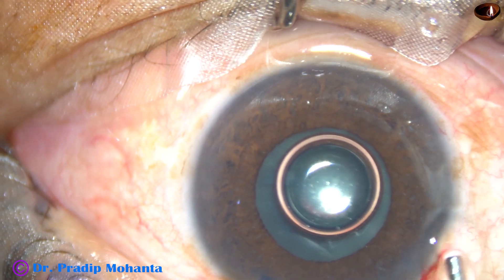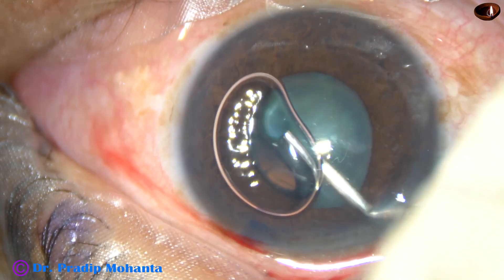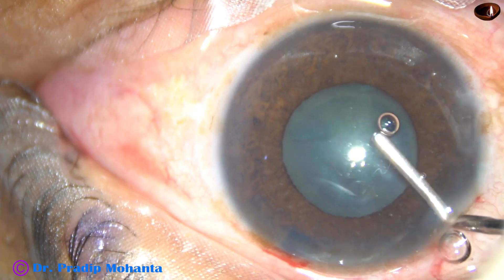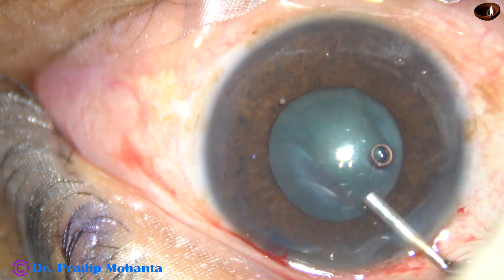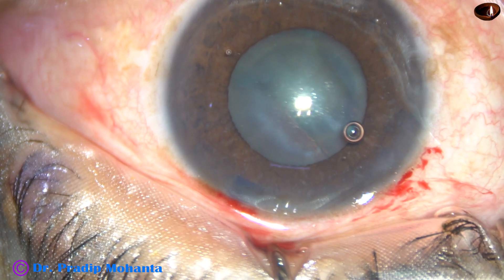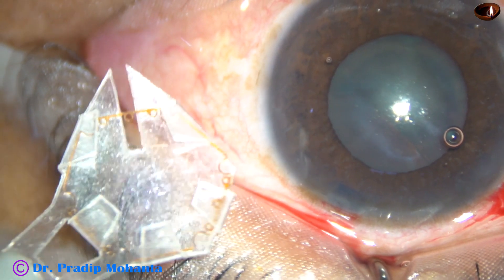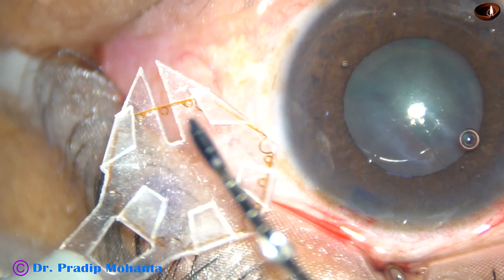So in this case, I have selected B-hex. Viscoelastic substance, 2% HPMC is being injected into the anterior chamber. The anterior chamber is underfilled and a little bit of Viscoelastic is injected under the iris to create a space so that the flanges that go under the iris find some room there.